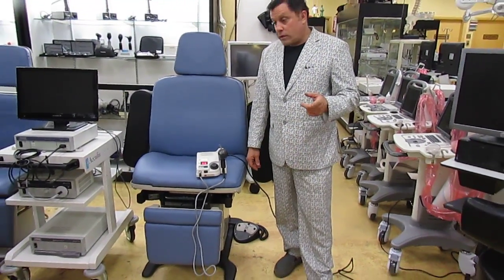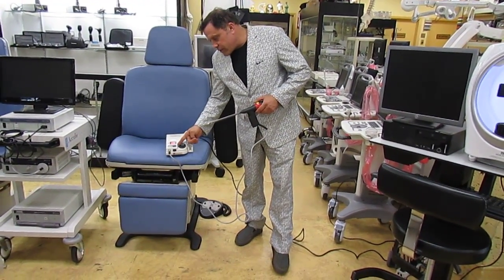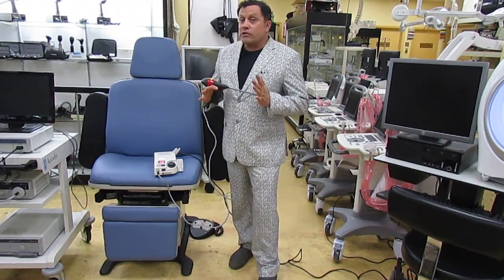Rob here with the Doctor's Toy Store. Today I have the IRC 2100 made by Redfield. IRC stands for Infrared Coagulator — it uses light to perform its function.